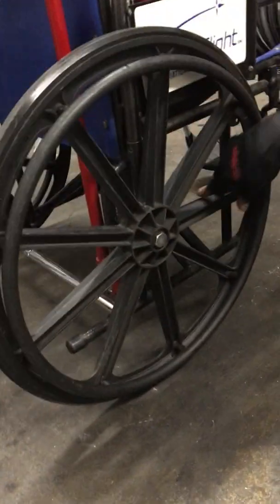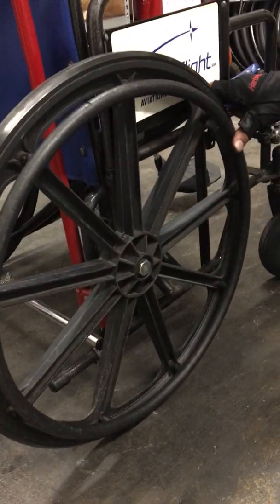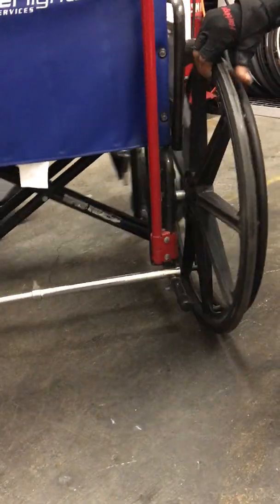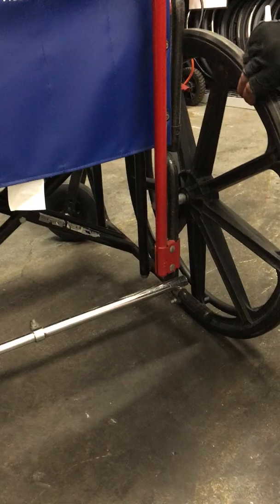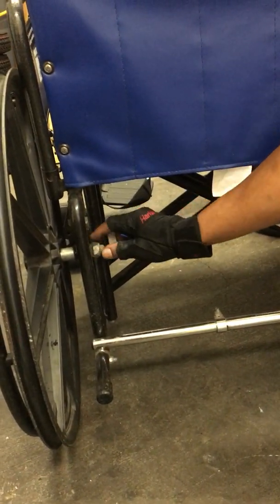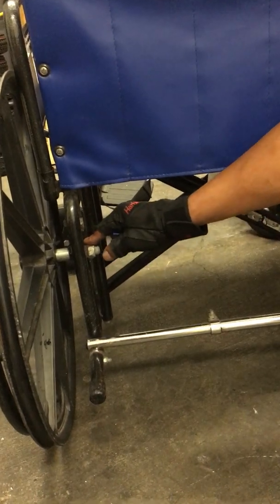Next, the wheels. The wheels do get rusty a lot of times, and if I were to turn this, I'm sorry, this nut right here and this bolt will get very rusty, and normally it takes about 20 to 30 minutes on both of them.